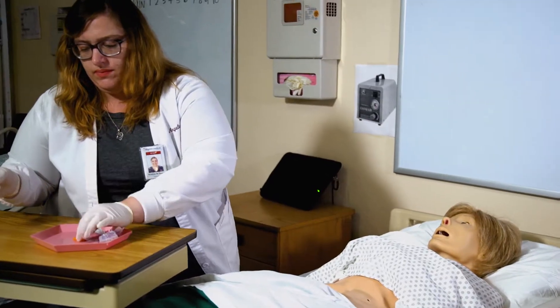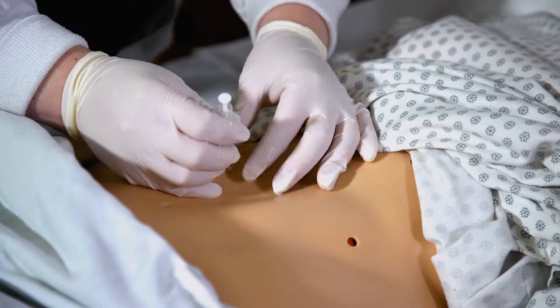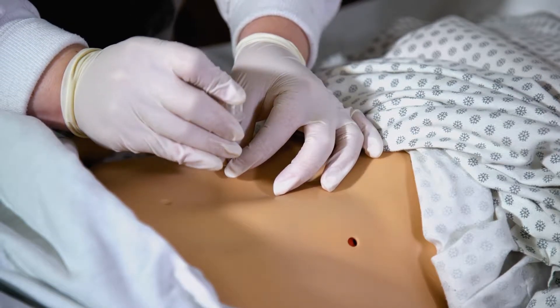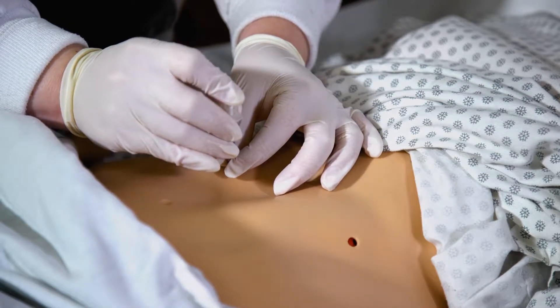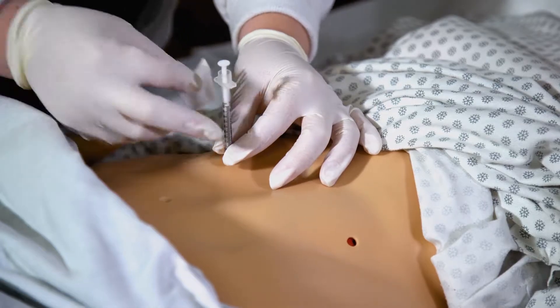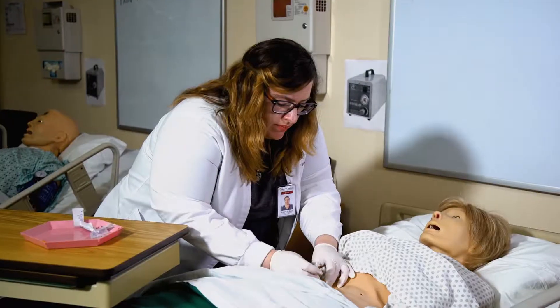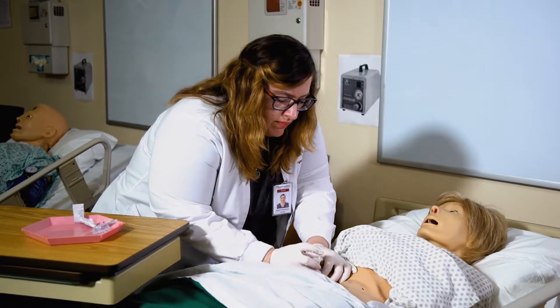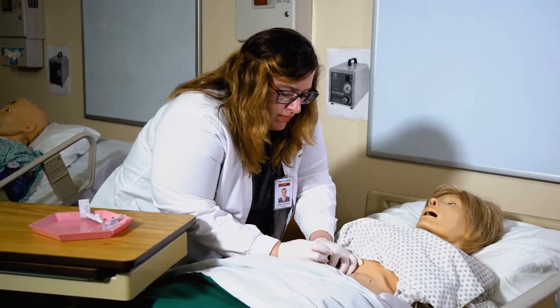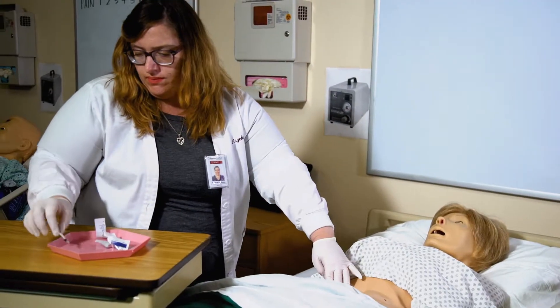Pull the cap from the needle. Administer the injection by holding the syringe between the thumb and forefinger of the dominant hand like a dart. Pinch the skin with the non-dominant hand. Inject the needle quickly and firmly at a 45 to 90 degree angle. The angle will depend on your client's size and amount of adipose tissue. Release the skin.